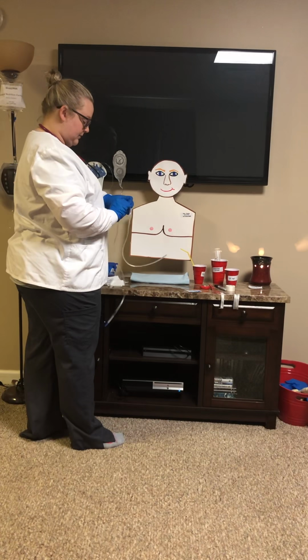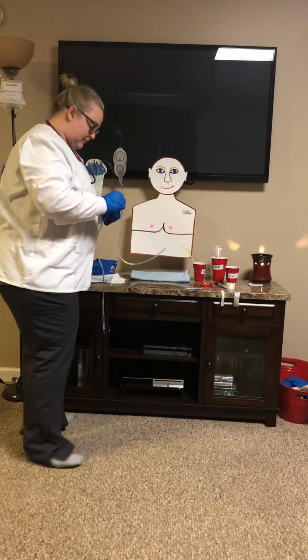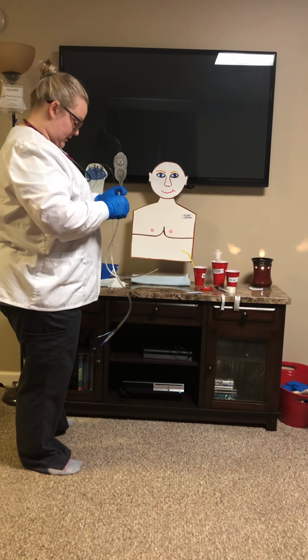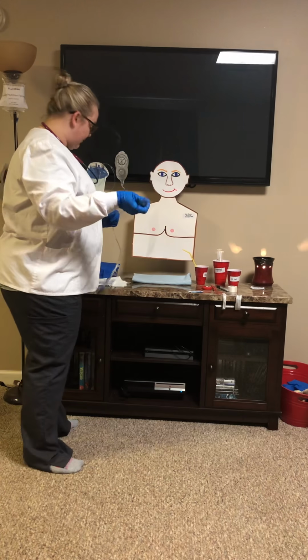I hate silk tape. Okay. I'm just going to keep going. Okay, so it's tape there for a marker.